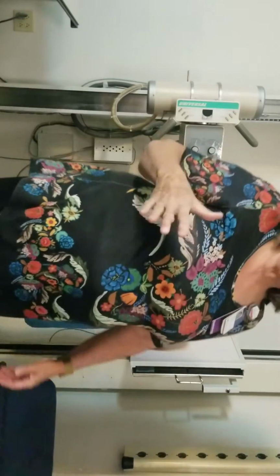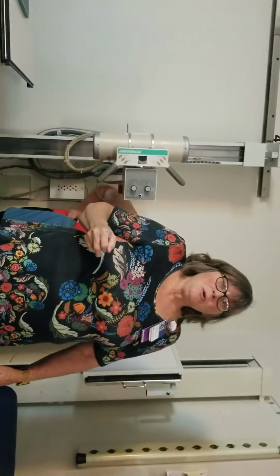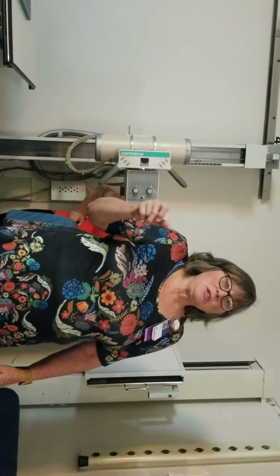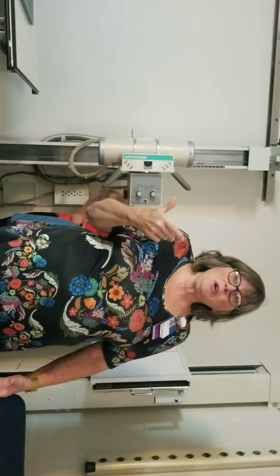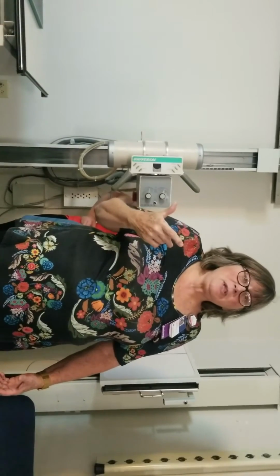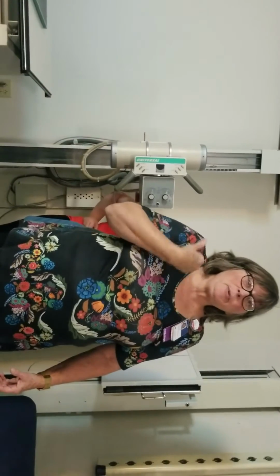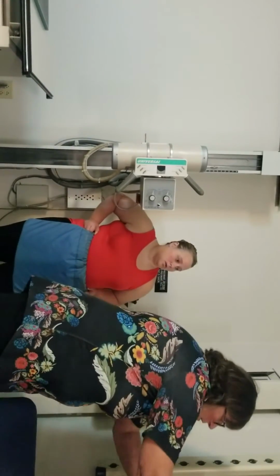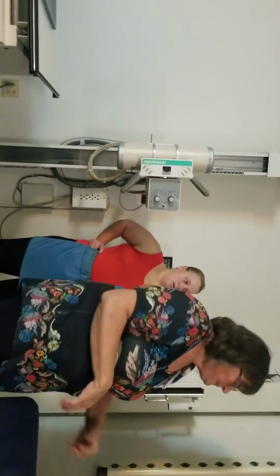So, what size of image receptor did I use? 10 by 12. What orientation? Portrait. Because it's longer than it is wide. Now, I'm going to go to the clavicle. What do you think I'm going to do different? I'm still going to use the 10 by 12. Landscape. I'm going to put it landscape because now my clavicle goes across the body, right?